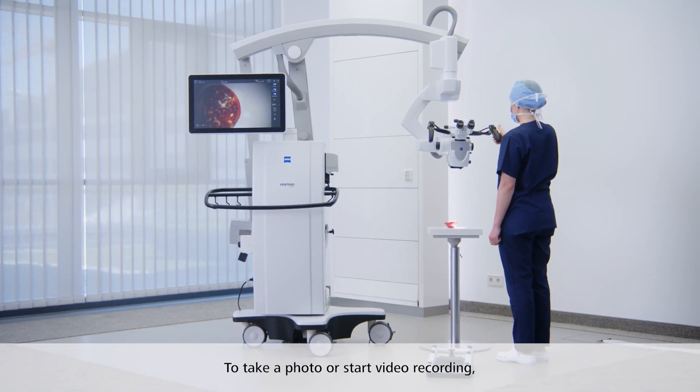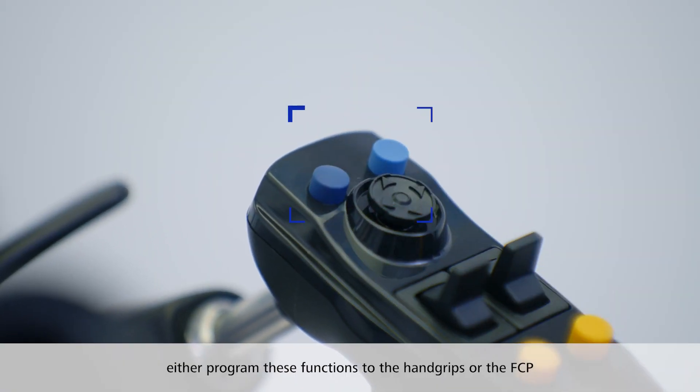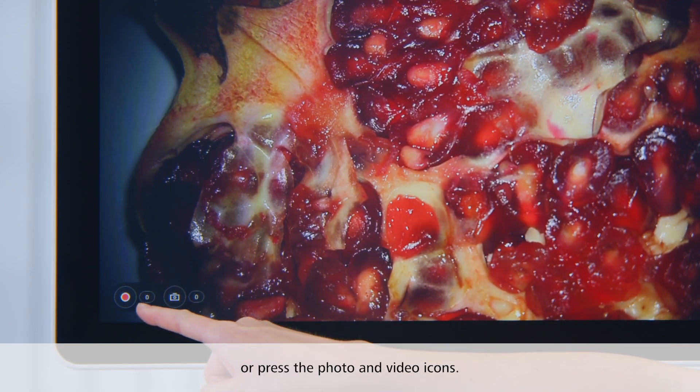To take a photo or start video recording, either program these functions to one of the buttons on the hand grips or the foot control panel, or press the photo and video icons on the touch screen.